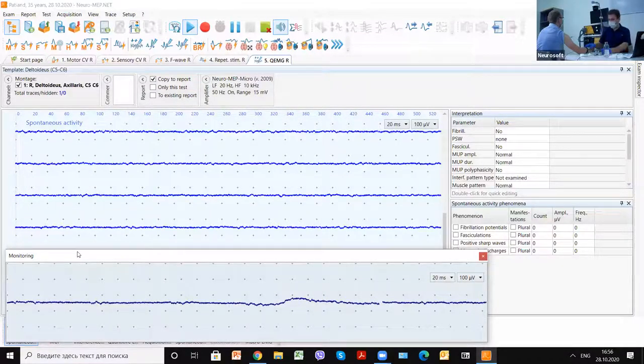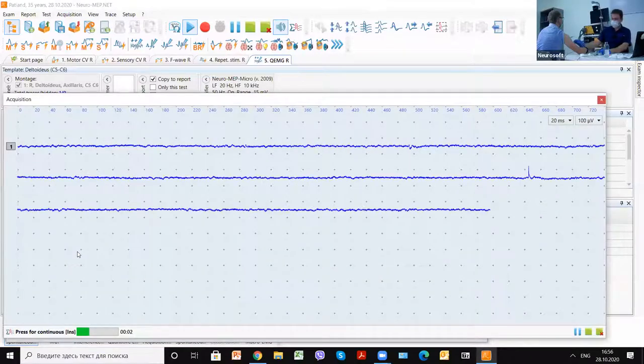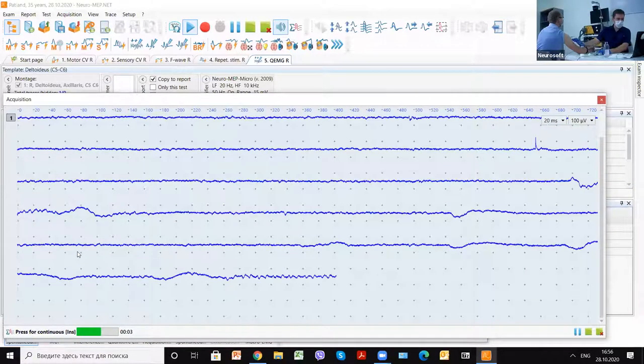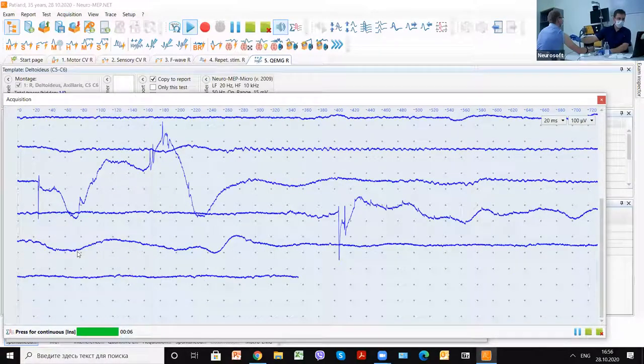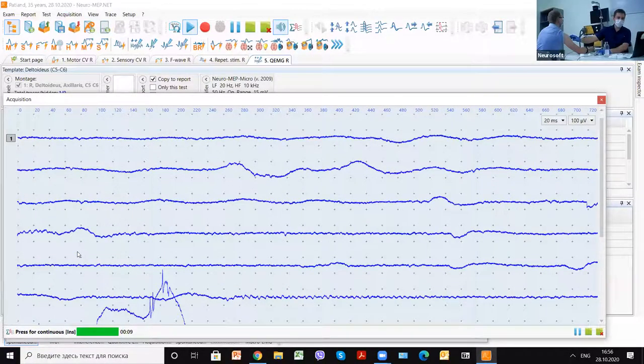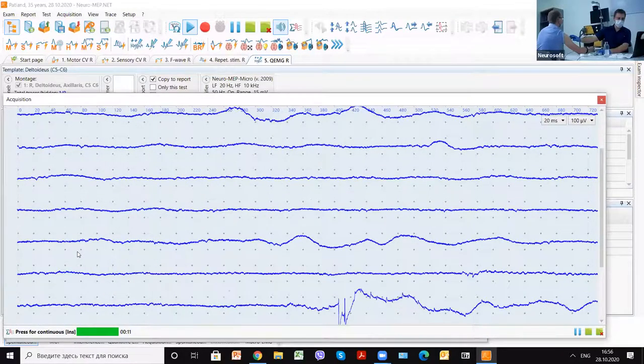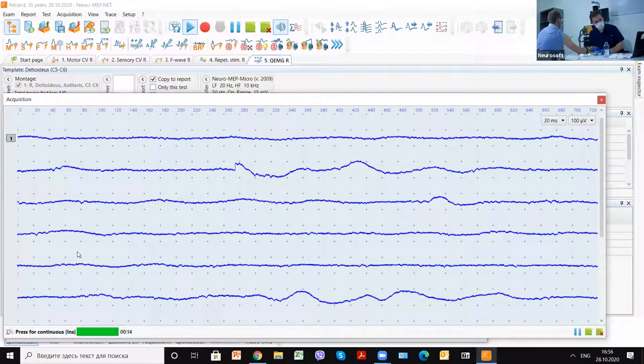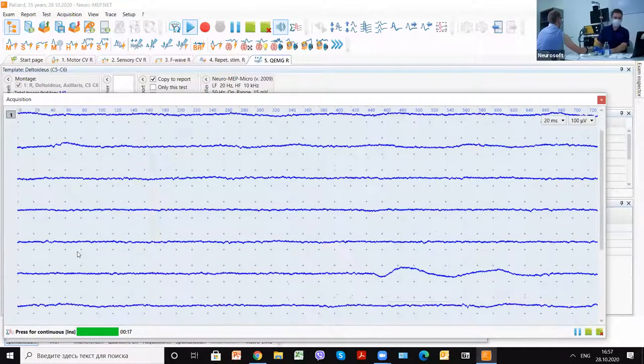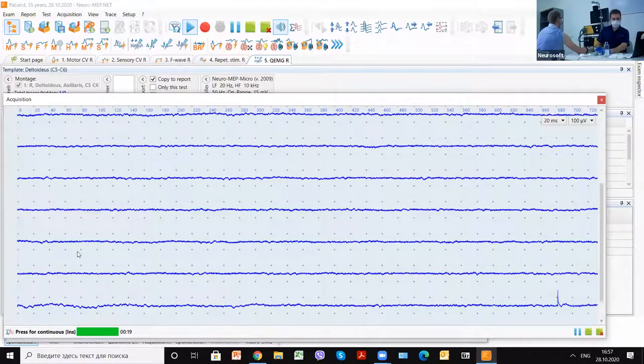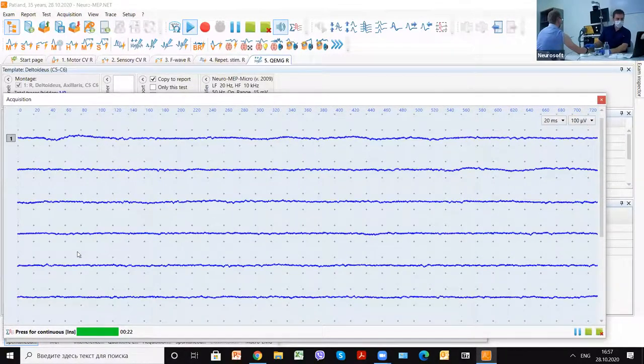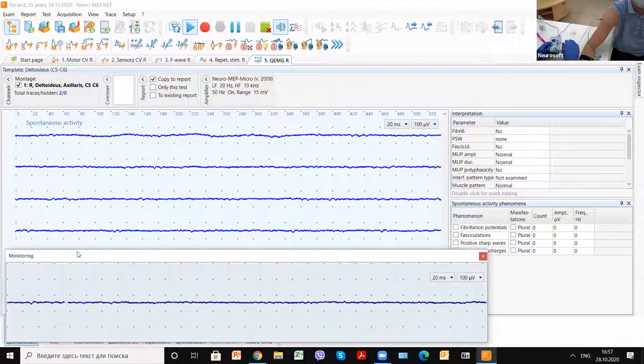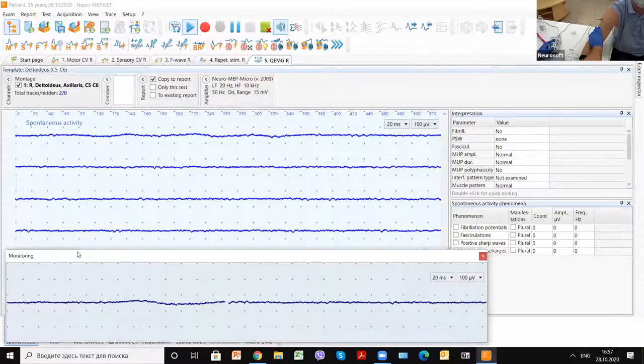But as it looks like, sometimes it must be fibrillations or fasciculations when they're big. All of them connect with different neuromuscular diseases and problems. After that, we don't have any spontaneous activity, so we go to the motor unit potentials.